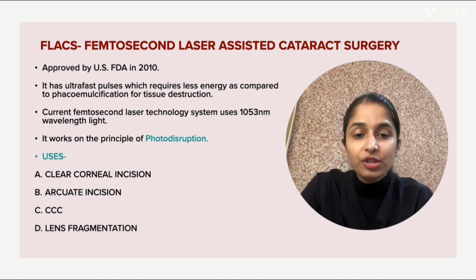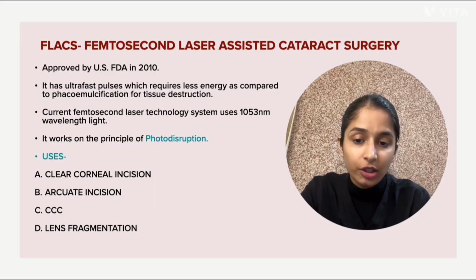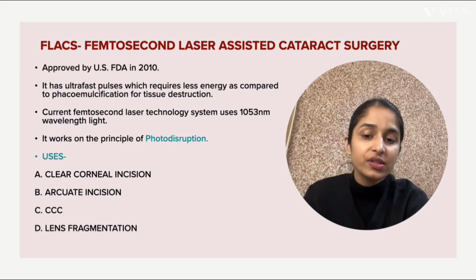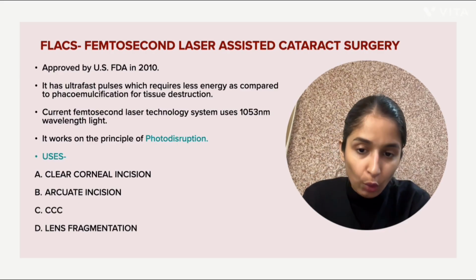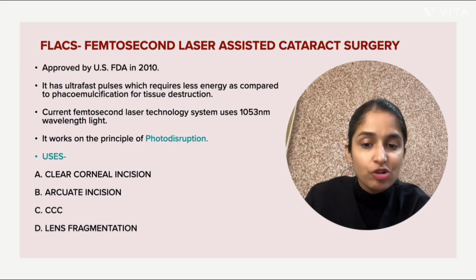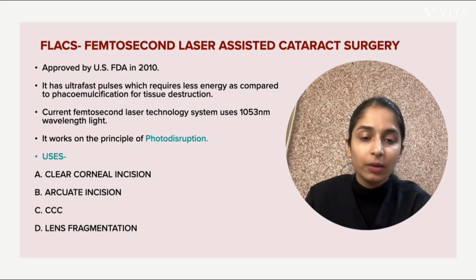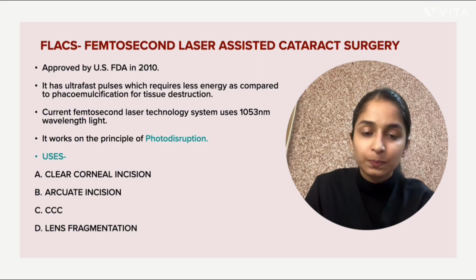And the most impressive part is that the laser creates a perfectly centered circular opening in the lens capsule. Before the surgeon even enters the eye with a phaco probe, the laser has already pre-chopped the cataract into small cubes, making the removal easier and gentler.